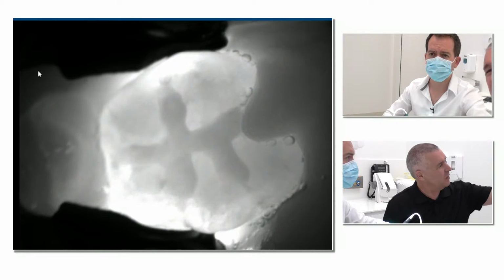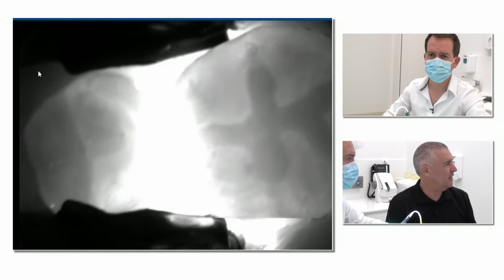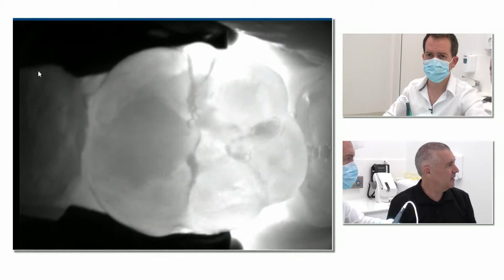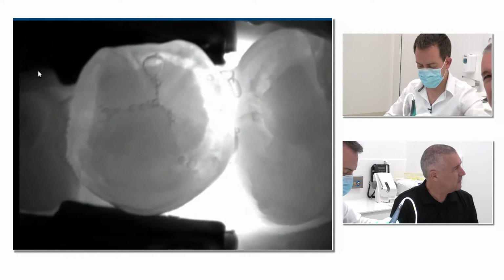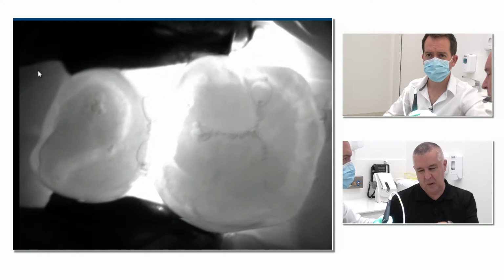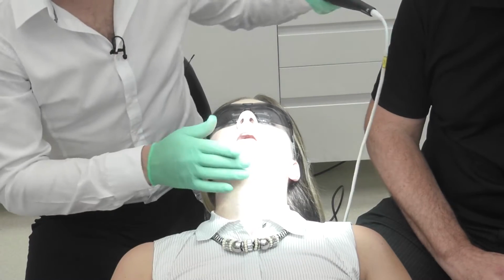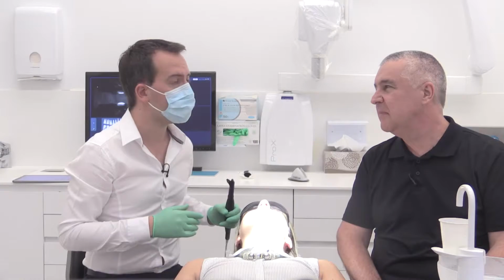Now this is a beautiful example of, you can just see the existing resin there in the tooth very, very clearly, looking around that. Some funky little fissures happening there. So while it's a little bit awkward, it's not actually painful for the patient to feel these little tips running around the side. No, I find patients tend to respond to it quite okay as long as you let them know there's going to be some pressure.